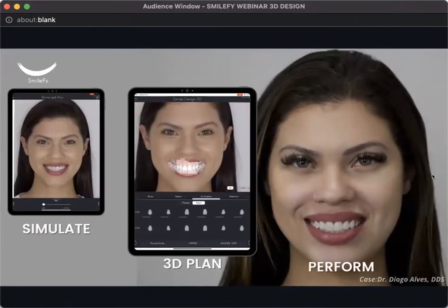Then 3D plan your own cases using the newest 3D design powered by SmileFy automated solutions to then perform different types of procedures. I see here that a lot of you guys are general dentists and also prosthodontists.